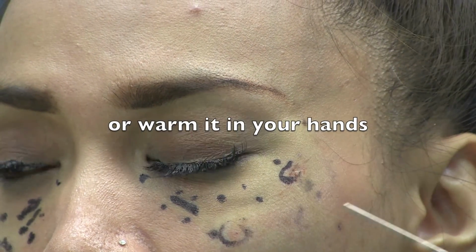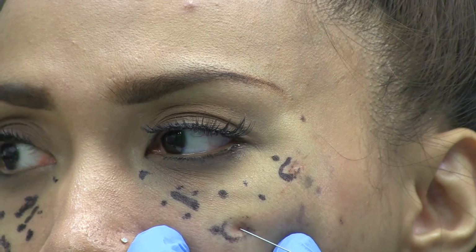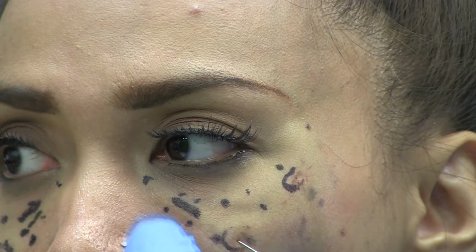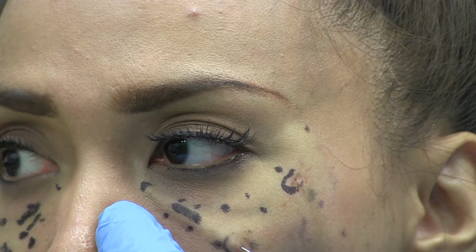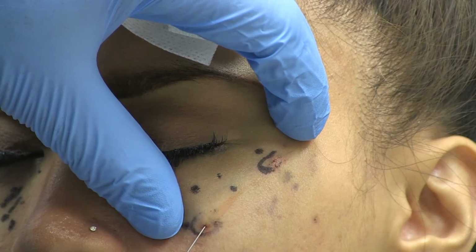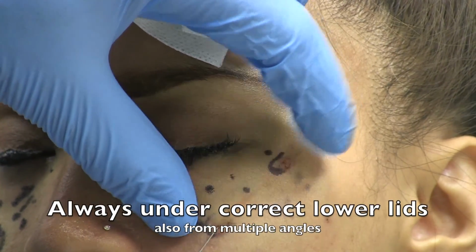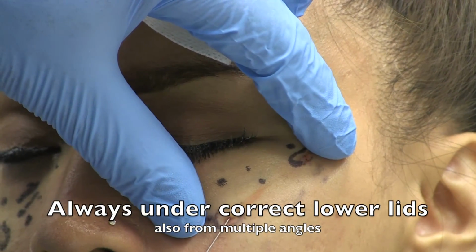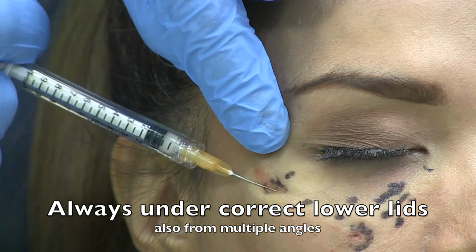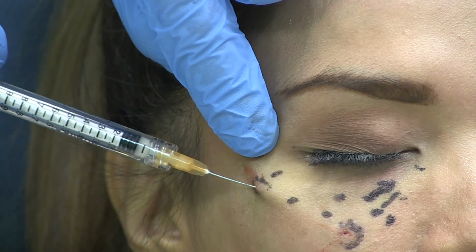Never obviously put it in the microwave. So first, you put the cannula on tight with your fingers. Then I like to use pliers to make it even more snug, since if it pops off and you squirt that product on the patient's face, you've lost several $100s. So then you inject the amount you predetermine as enough, preferably for a 50% correction or less, and inject from multiple angles, realizing you're going to be doing it again several months from now.